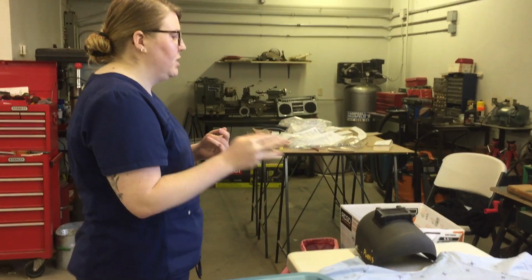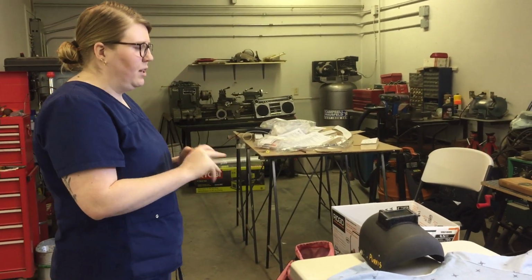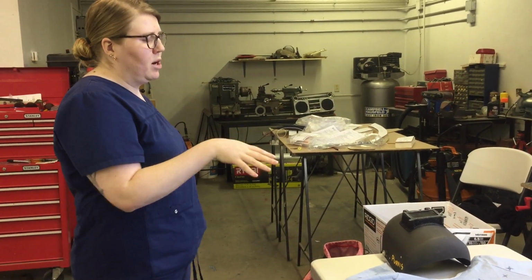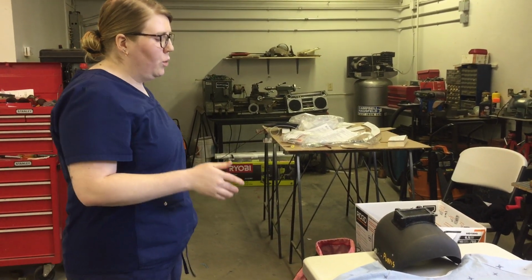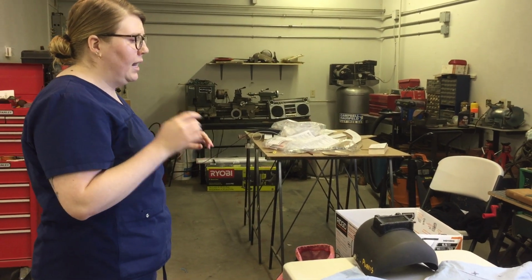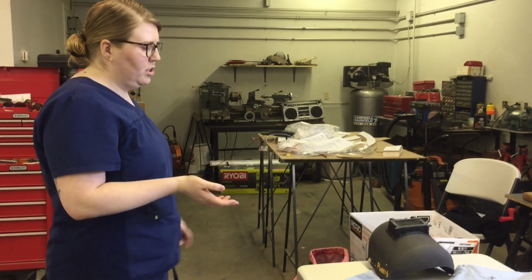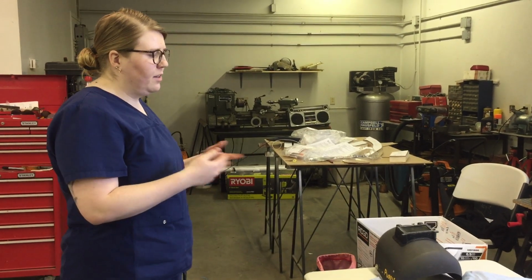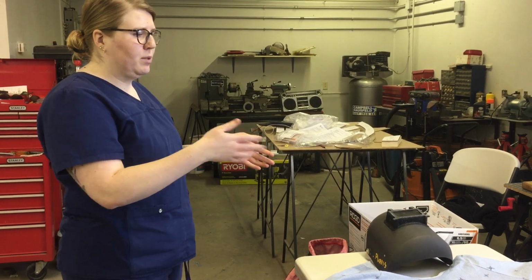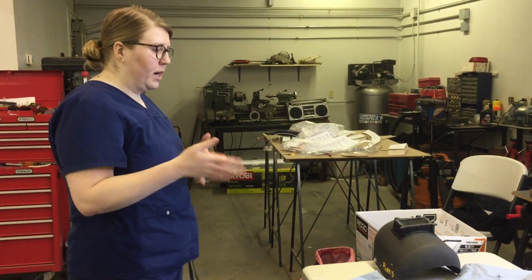So today, as per doctor's orders, we're going to be giving you an injection. It's going to go in your ventrogluteal, which we've already discussed with the patient, and we'll landmark that later, but they're okay with that site. So we're going to be giving it into your ventrogluteal. It's going to be a needle that goes into your muscle and administers you medication for your nausea and vomiting for your chemotherapy. Once I've explained that to the patient, I'm going to make sure I raise the bed to the proper height and expose them accordingly before I give the injection.